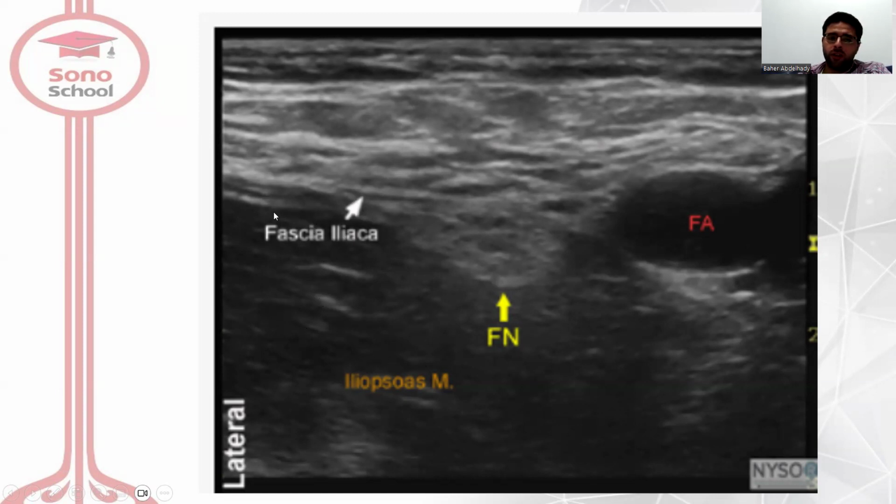If we come in with the needle from lateral to medial, just before the nerve, a few millimeters before, you can inject saline as hydrodissection or hydrolocation to be sure where the tip of your needle is. If you are sure you are in the right position, immediately replace the saline with local anesthetic and start to inject.